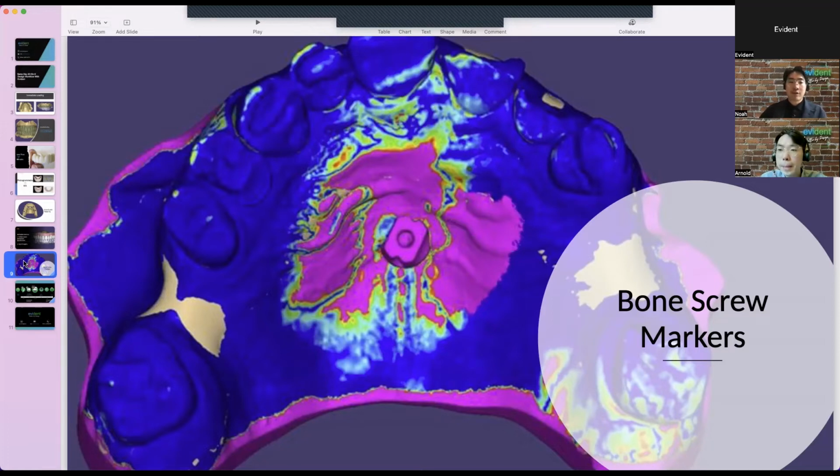You just need to make sure that you can justify it from an ROI perspective and that you are actually seeing a lot of implant cases. After that, it's really just a 3D printing setup: a scanner, a 3D printer, a curing machine, and a washing machine. And then of course your long-term provisional resin of choice.